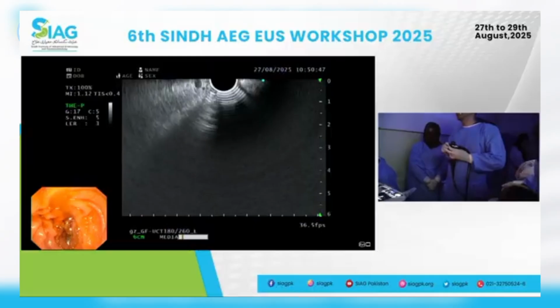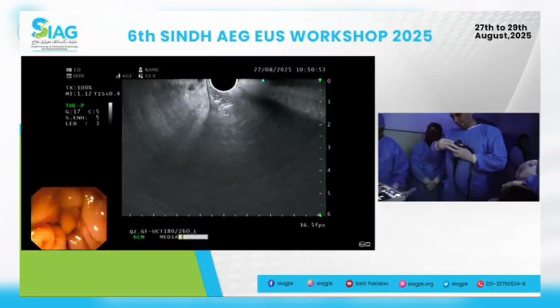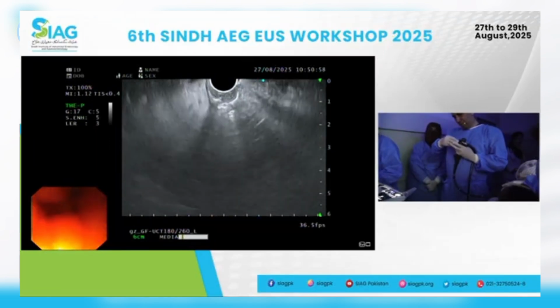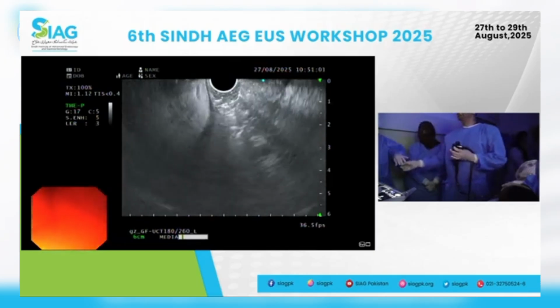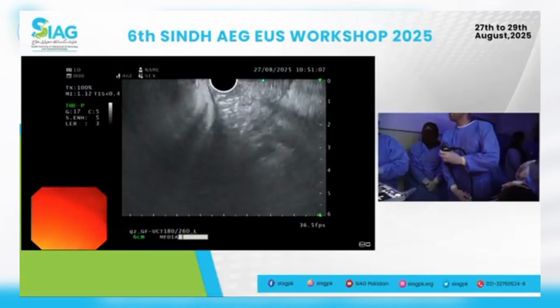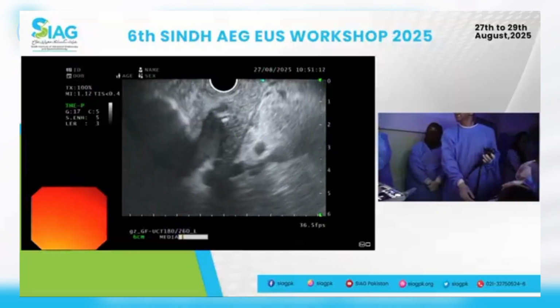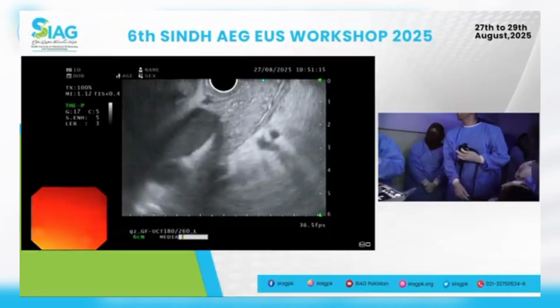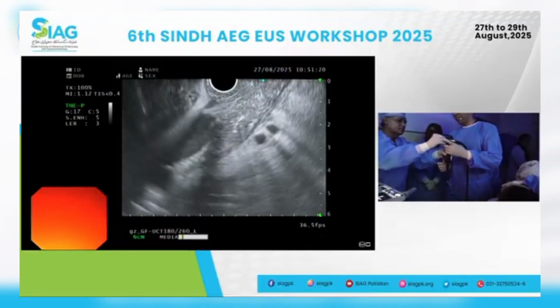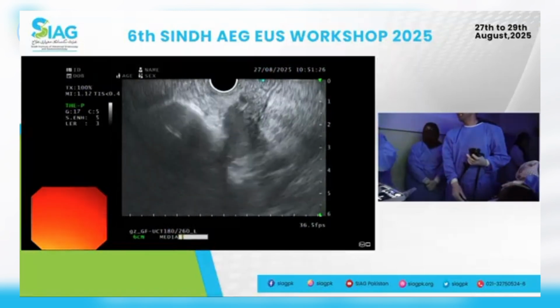It's okay. I've just taken the suction button off. Okay, good. नवा बटन दे दो प्लीज. हाँ जी, thank you. Good, thank you. That's much better.